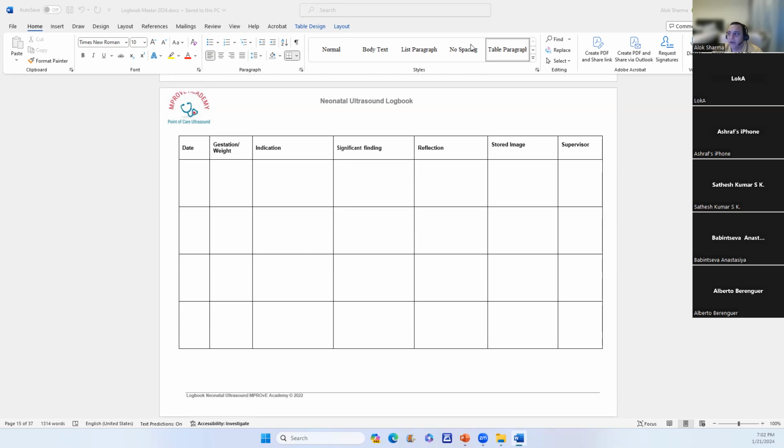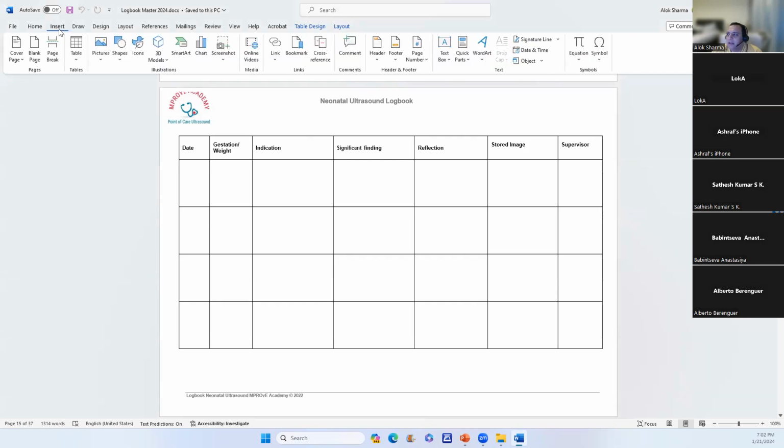How do you store files? I'm just going to go through it with you. When you go to the insert column, just over here, you would have a file stored as a PowerPoint, with the case history and the images embedded, as I will show you today. A small file, I'd say 4 slides, presents the history, your anterior and lateral views, and the fourth slide, if you can, anonymizes your chest x-ray, so you can use that as your gold standard for the diagnosis.